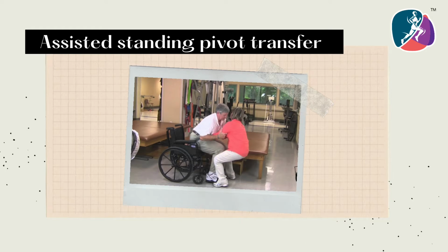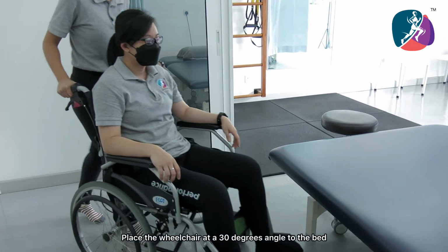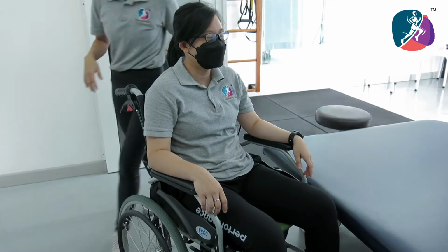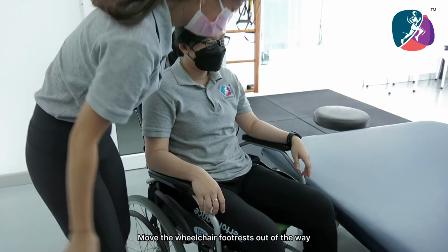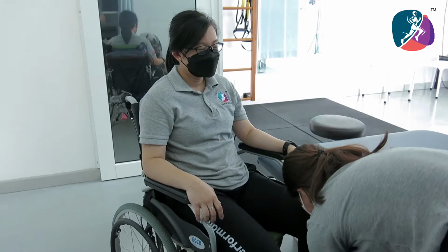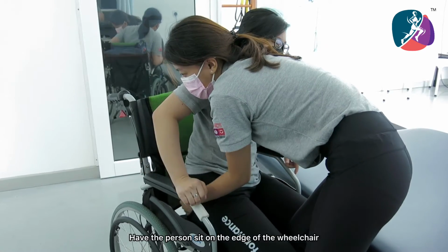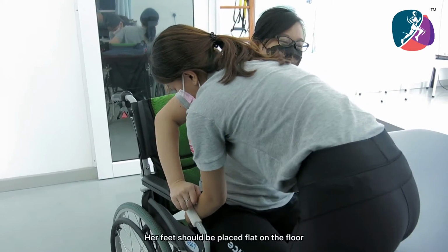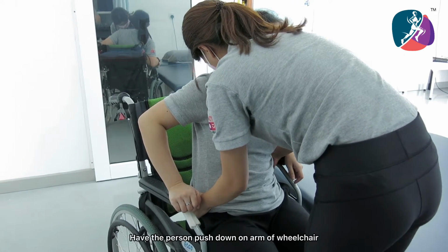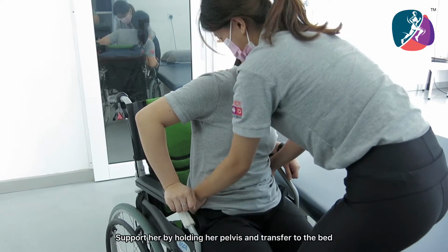Assisted standing pivot transfer. Place the wheelchair at a 30-degree angle to the bed. Be sure that the wheelchair is locked. Move the wheelchair footrest out of the way. Have the person sit on the edge of the wheelchair. Her feet should be placed flat on the floor just behind the knees, and have the person push down on the arm of the wheelchair to assist in rising. Support her by holding her pelvis and transfer to the bed.